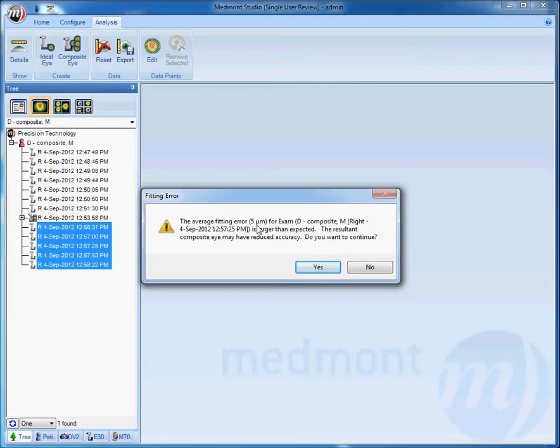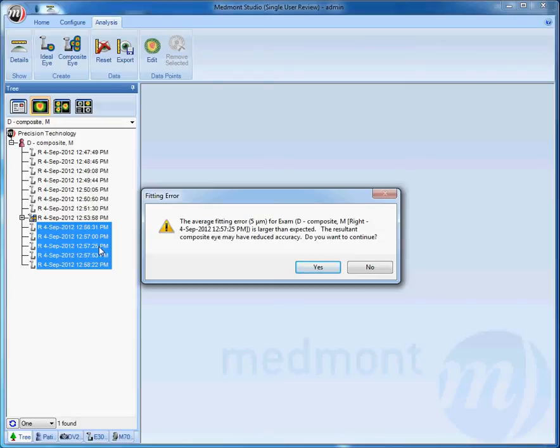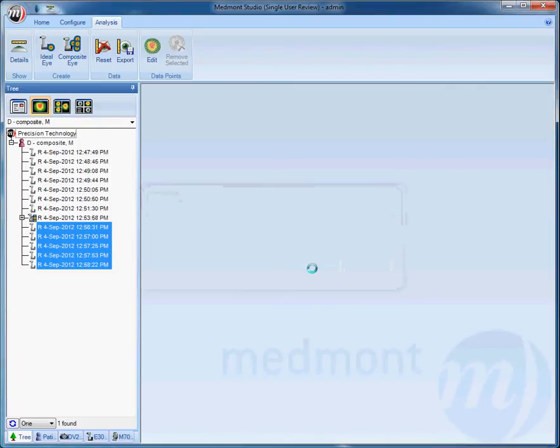In other words, this image should be retaken prior to doing a Composite Eye. We should eliminate the third image, 12:57:25, retake that fixation, and then calculate the Composite Eye with five or more quality images.